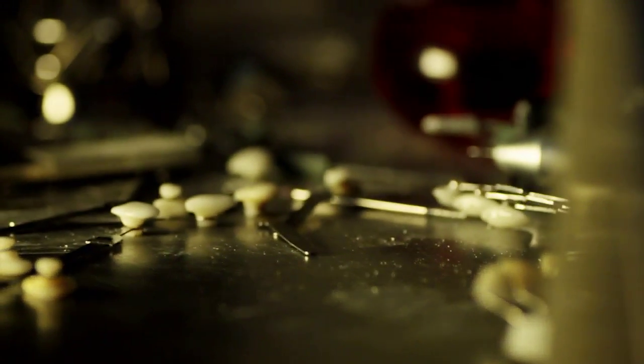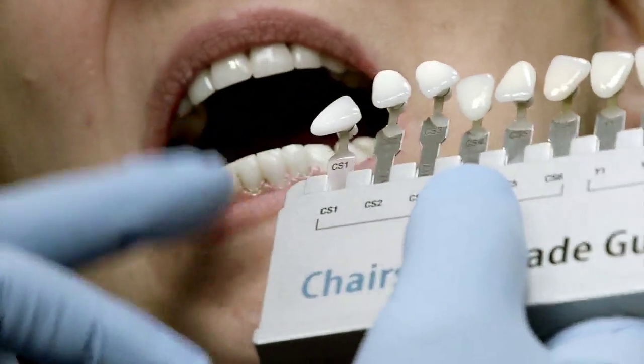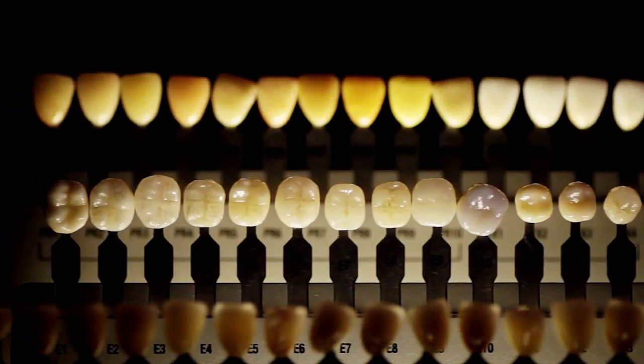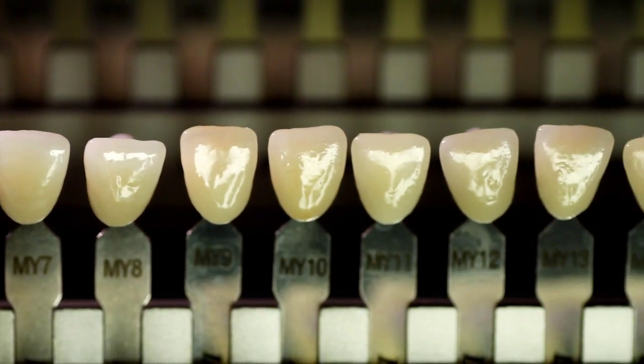Nature changes the face of everything in time. Your best work in aesthetic dentistry is gauged by your patient's satisfaction with their new restoration. The natural look of a restoration is heavily dependent on the color variations and other characteristics, which vary from age group to age group. Certainly you have faced frustration time and time again when having to choose the best color match for your case. As an individual ages, the various characteristics of their teeth, including the color and translucency of their dentition, will change as well.